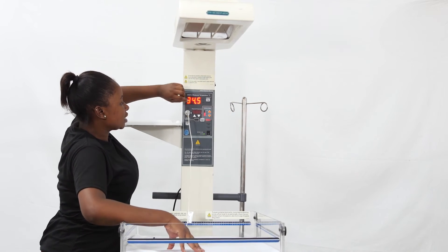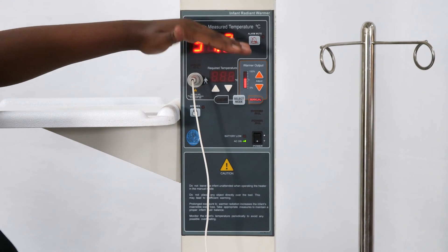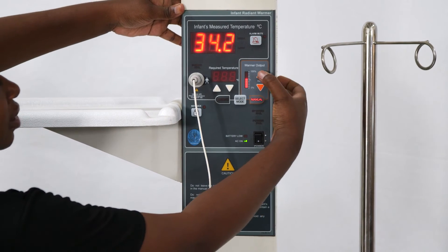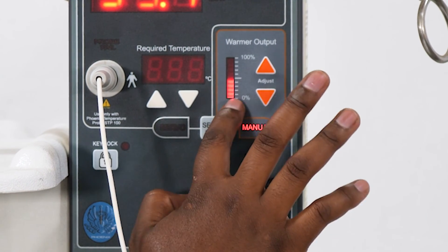In this mode, you decide the warmer's output. The machine will no longer adjust the heat it produces in response to readings from the probe. You can see the output level on the bar next to the arrows. It is measured in percentage.